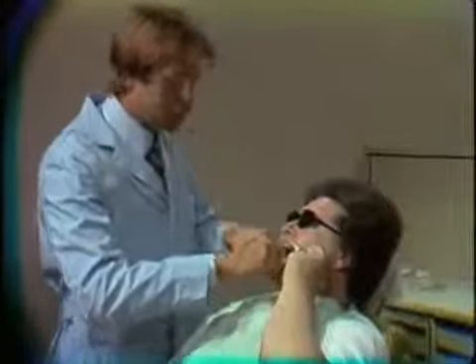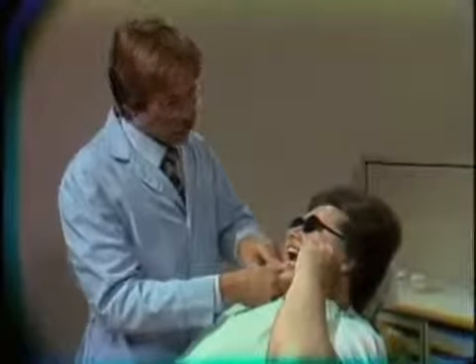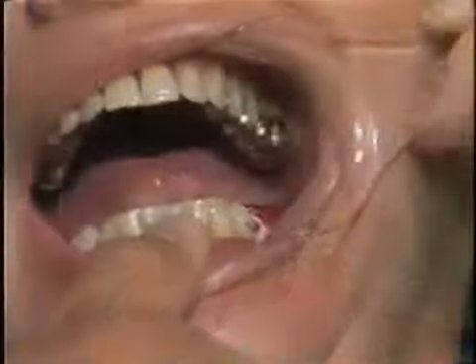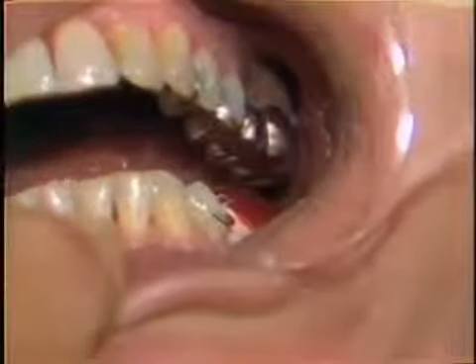And the first position that we're going to record, open. Now, we want to look at that posterior area. Let me hold this back here. And I'm going to register the centric relation. Tilt your head down just a little bit. The centric relation position first. The centric relation, centric occlusion position. Okay, now I'm going to close you up into the wax.